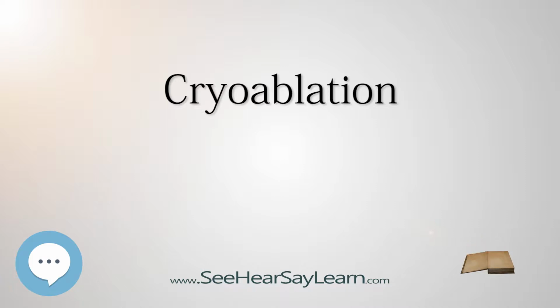Prostate. Prostate cryoablation is moderately effective but, as with any prostate removal process, also can result in impotence. Prostate cryoablation is used in 3 patient categories. As primary therapy in patients for whom sexual function is less important or who are poor candidates for radical retropubic prostatectomy, RRP, surgical removal of the prostate.